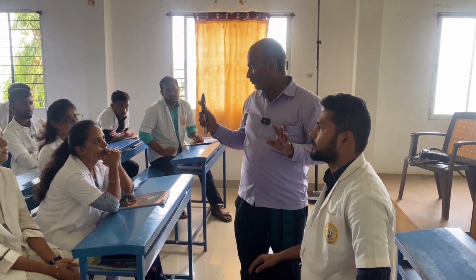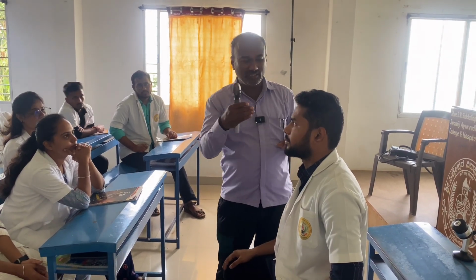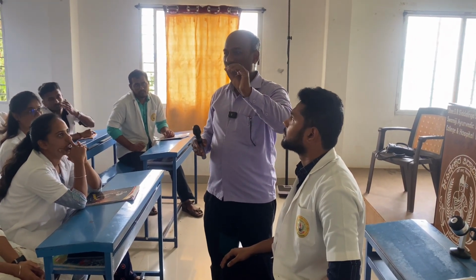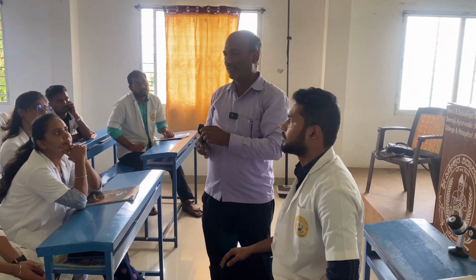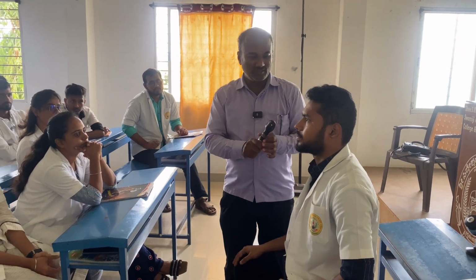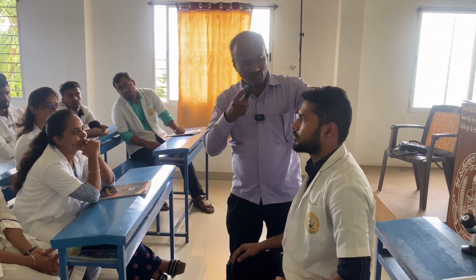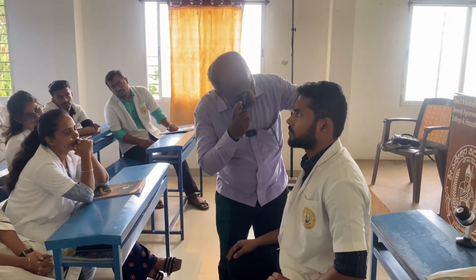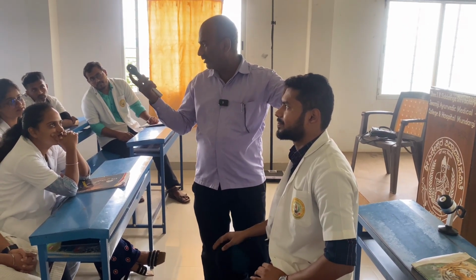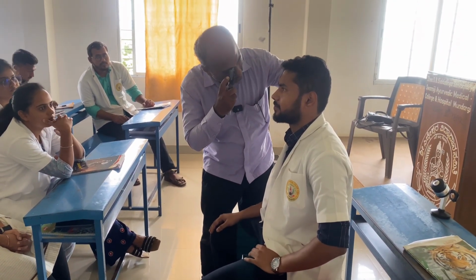So you have to see the glow. You have to send the light indirectly inside the patient's eye. If you put the light directly through the pupil, the light will be perceived and the pupil will be constricted. You will have very small glow. That may give you the wrong diagnosis. So always ask the patient to look straight, move temporally, because from this side the nose comes in between. Move temporally, look at the glow, adjust, looking straight ahead. Adjust your refractive area, refractive errors and the indices difference, right? And look at the glow, right?